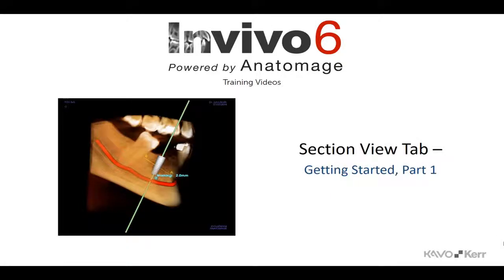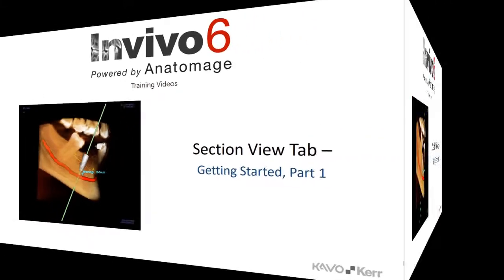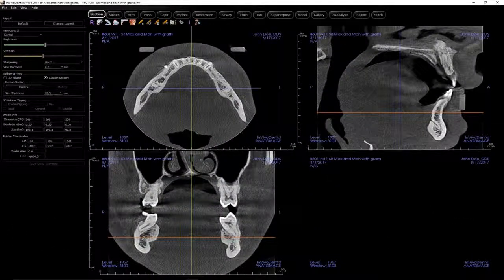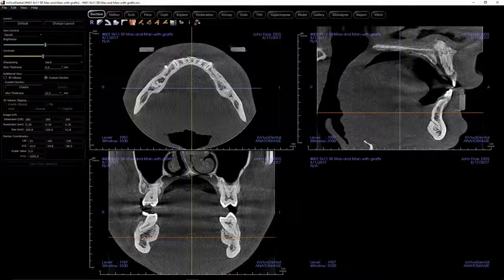This training series will demonstrate how the software can be used to display 3D volume renderings, create cross sections, trace nerves, place virtual implants and restore them, print images, save images, and many more functions. When a patient scan is open, you will begin in the Section View tab. This tab will be a good place to begin our discovery of the software and is the subject of this tutorial.